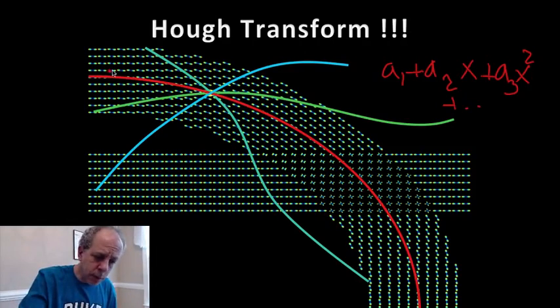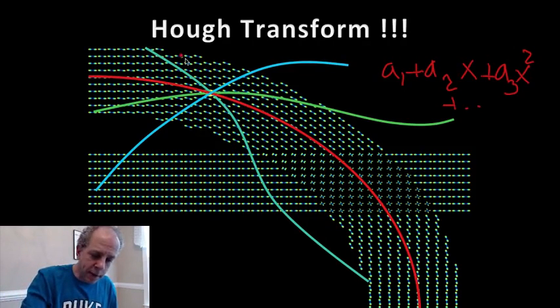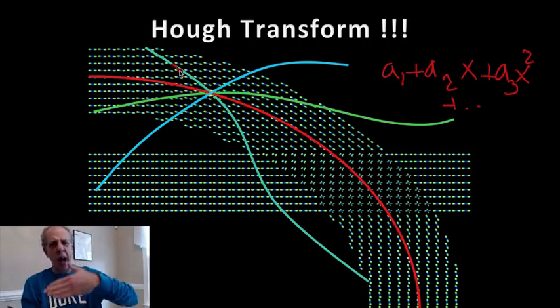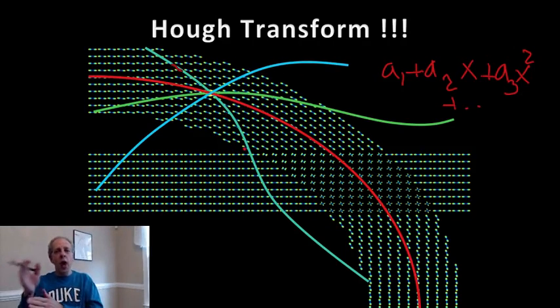Very simple. Remember, at every voxel, we have the probability of going in every direction. So I take this curve and I say, is this a good curve? I go through the voxel and I say, what's the probability of going at that voxel in this direction? So basically the tangent to the curve. And then you go to the next voxel, go to the next voxel, and you keep going. So you add the probabilities that you got from the data of the diffusion MRI.